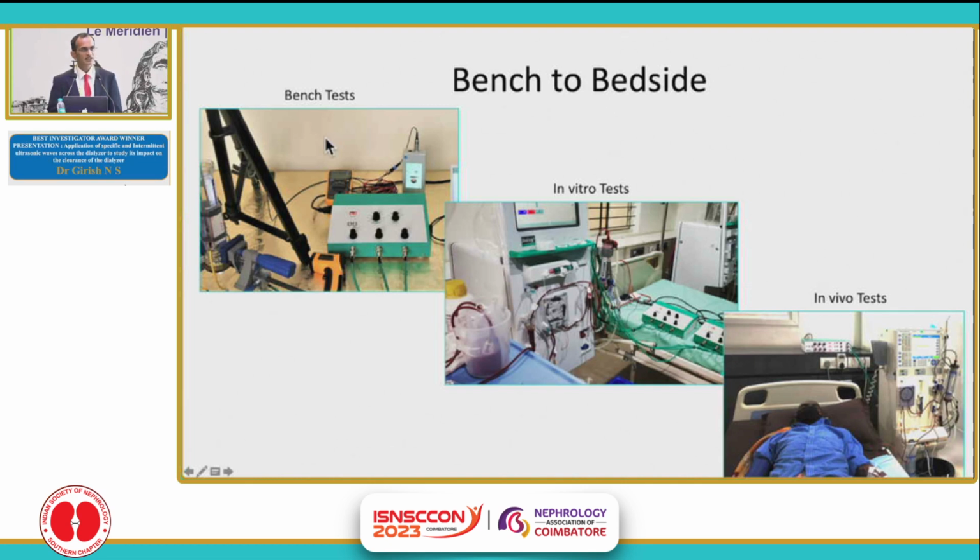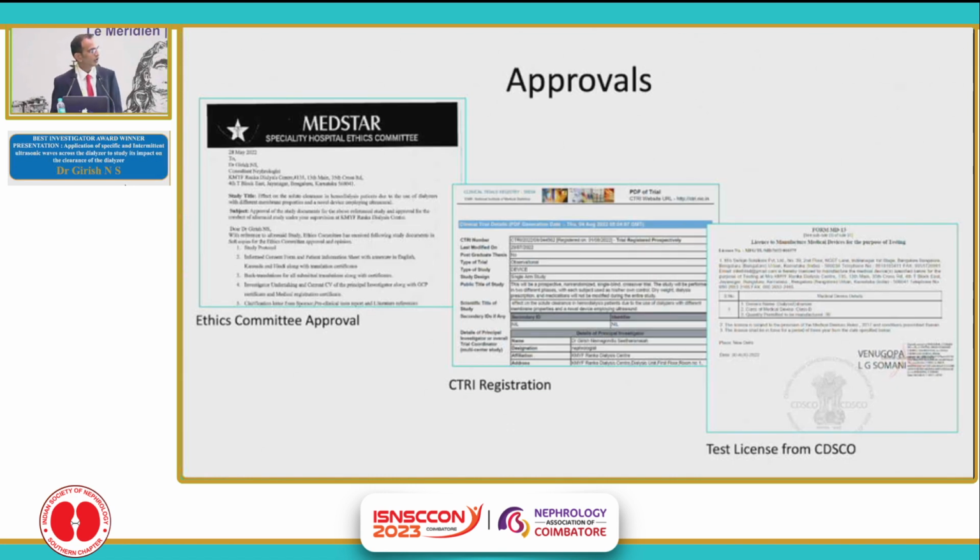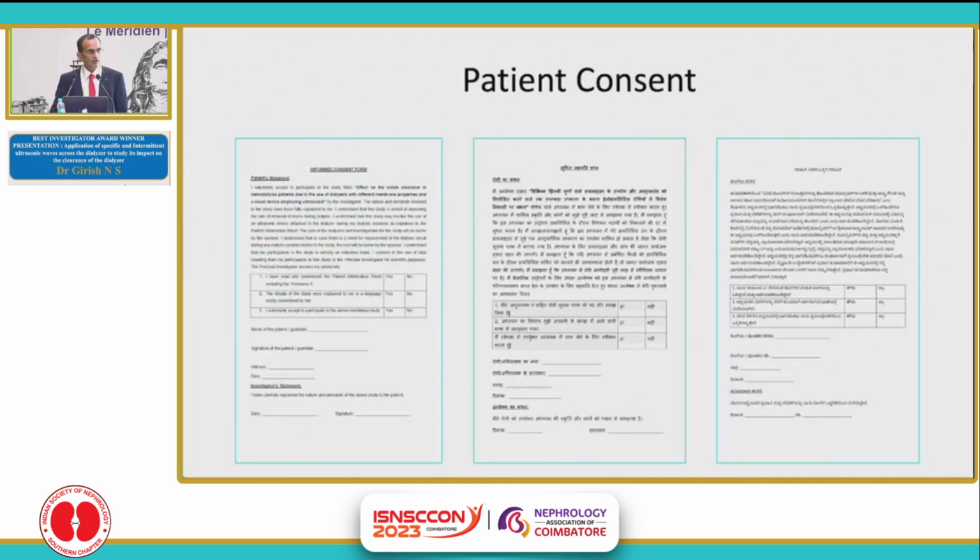So it went through tests of time from bench to bedside. First it was bench-side testing, followed by in vitro testing without patients, then subsequently in vivo testing on the patient, which is what the data I am going to present is on. We got all the necessary approvals, including CTRI registration and the device approvals. We took informed consent of patients in their own languages, and it was quite an elaborate consenting process. We gave them the forms, allowed some time to discuss with their relatives, and then come back to us.